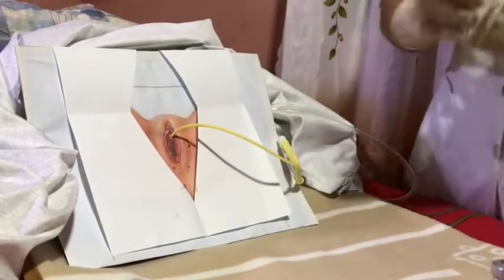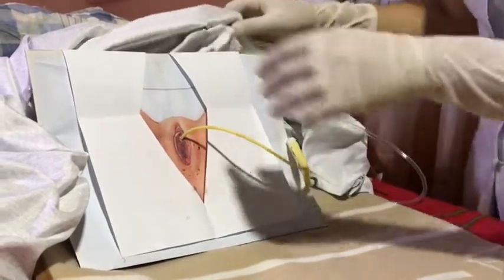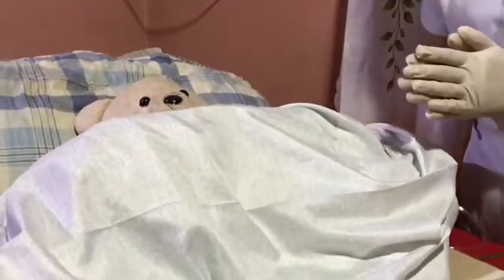And now, place the patient in a comfortable position. Alright, ma'am. I'll be wiping your genital area. Alright, we're done.